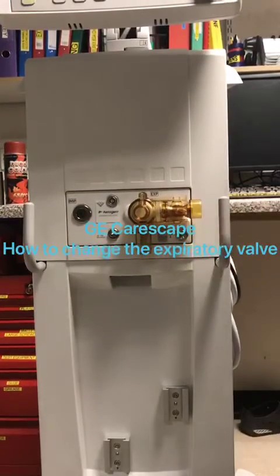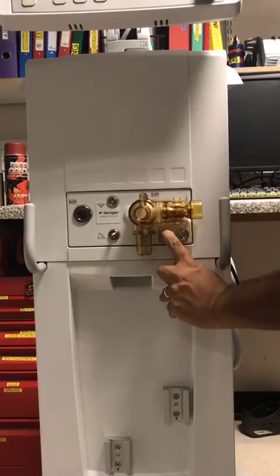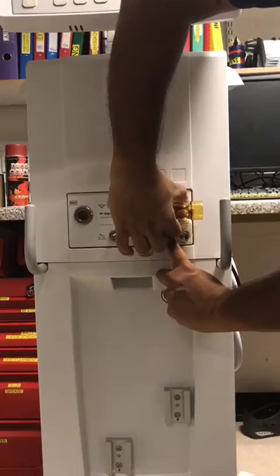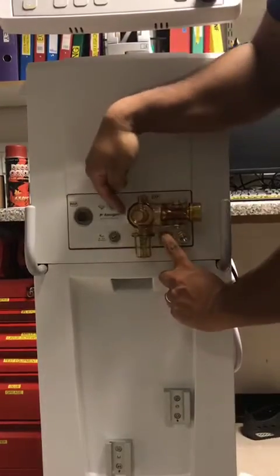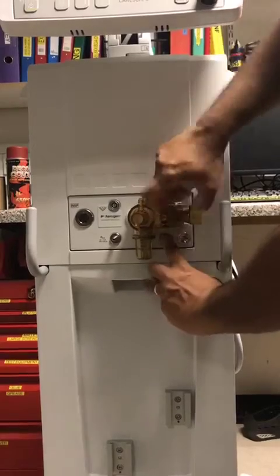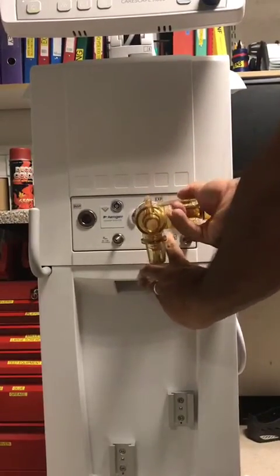You've got the expiratory valve over here. You've got a little grey button that you push down. You pull the expiratory valve towards you — there's a bit of a groove here and you just pull it out towards you and it comes off.